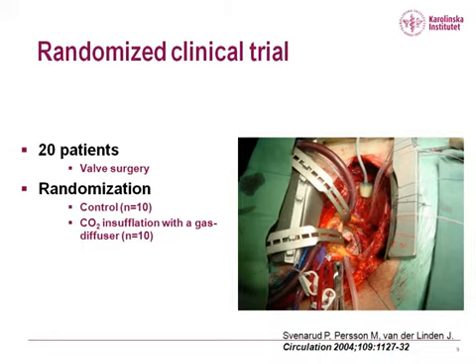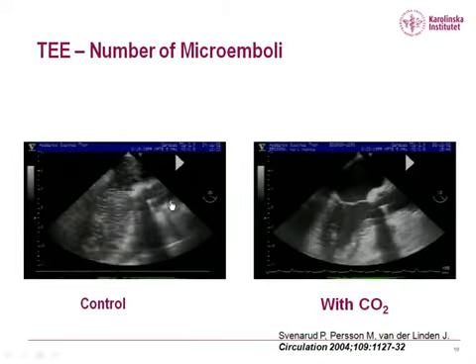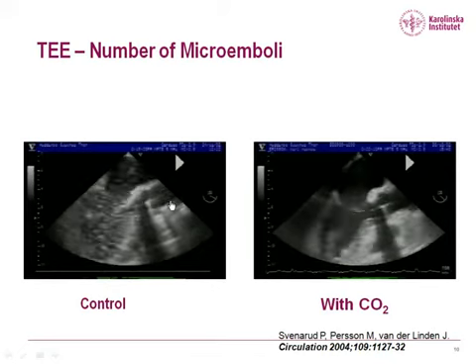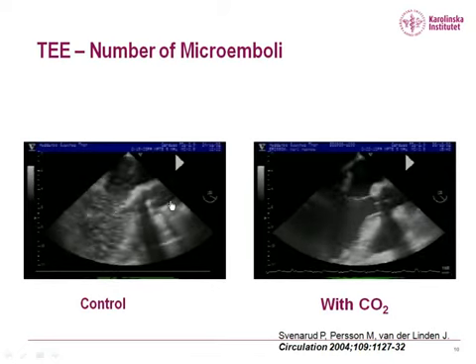We did a randomized clinical trial involving 20 patients some years ago. We randomized them to a control group or to CO2 insufflation with the gas diffuser. And we looked at the number of microemboli with TE. Here's a control patient. Here's a patient with CO2 after bypass.